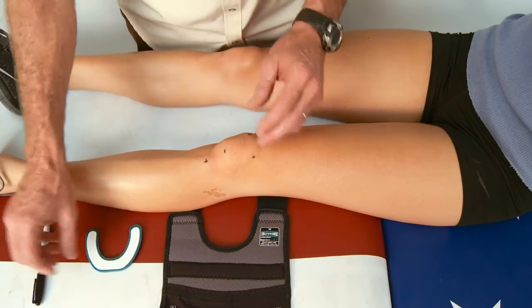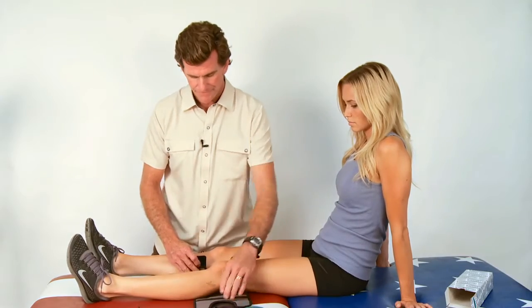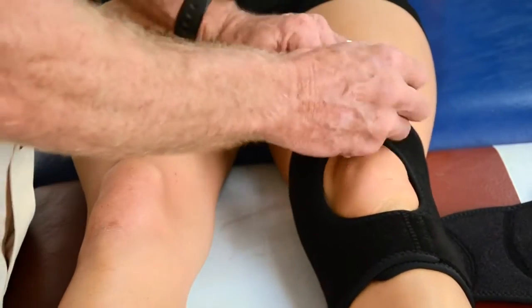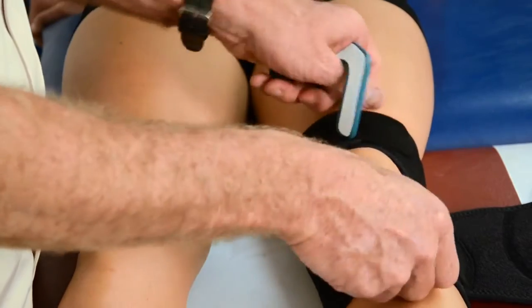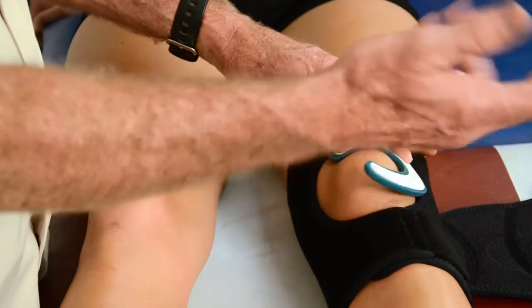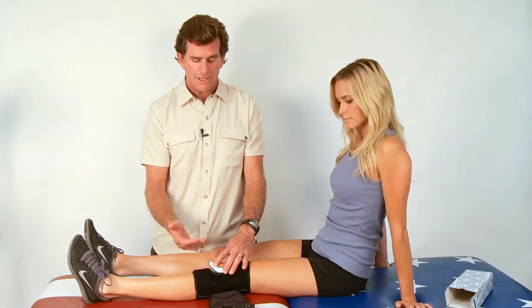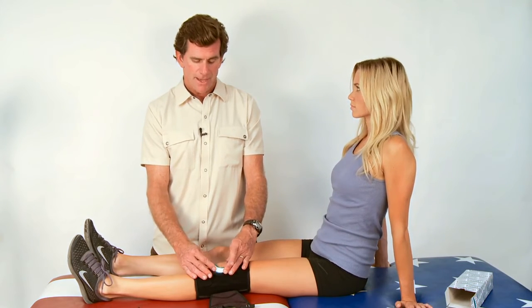When you're ready to apply the brace, we'll slide the brace underneath, apply the anchors, and once the anchors are in place, based on that clinical presentation of the patella, you can position the buttress where you want to. One of the great applications of the Shields brace is not only that it is universal, right or left, but if an occasional application where there's a medial versus a lateral application, that can be accomplished as well.